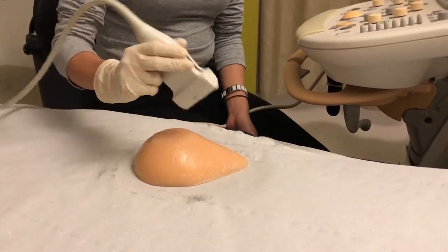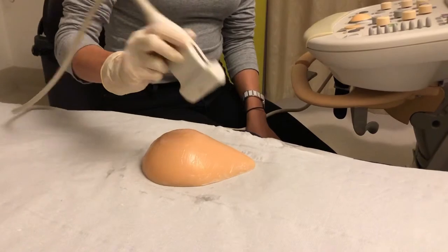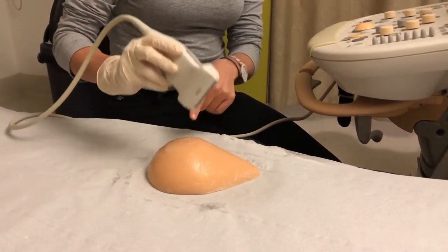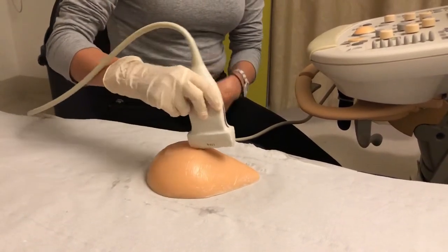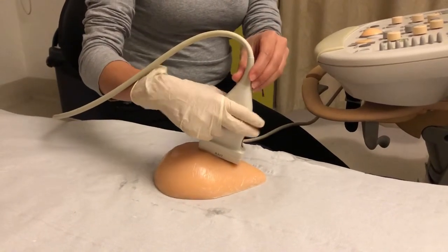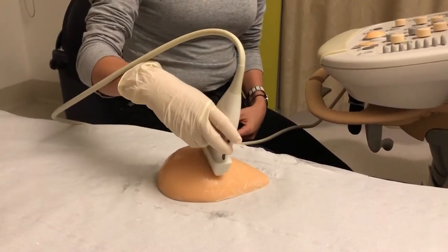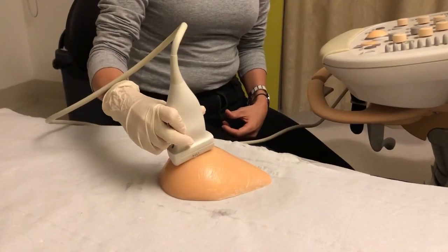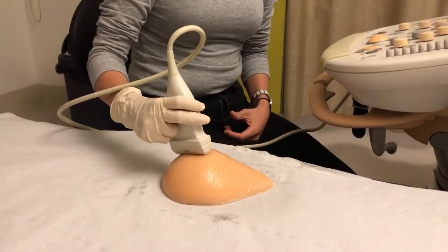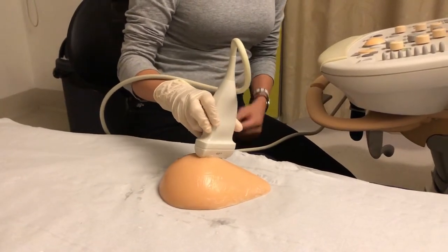This is a video demonstration of the radial technique. We start with the marker end pointing towards the head of the patient and the non-marker end staying on the nipple. It stays in this position as we pivot and go around the clock face of the breast from the 12 o'clock position all the way around the nipple until we reach the 12 o'clock position once again.